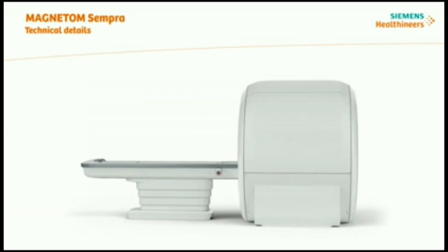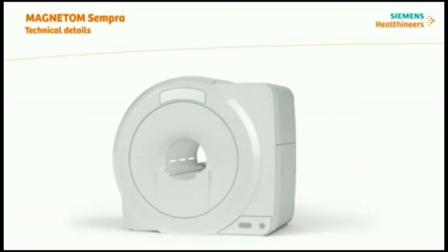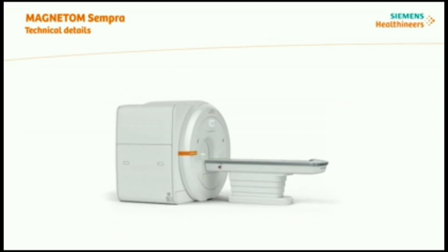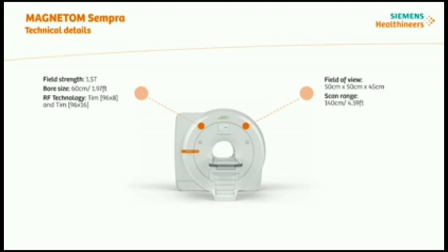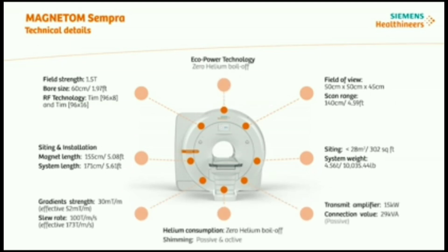The Magnetom Sempra comes equipped with the latest technological features, aiding you in obtaining excellent image quality and boosting efficiency. For example, the field strength is 1.5 Tesla with a 60 centimeter bore size. Field of view is 50 by 50 by 45 centimeters and has a scan range of 140 centimeters. Check out the following technical specifications for RF technology, siting and installation, and many more.